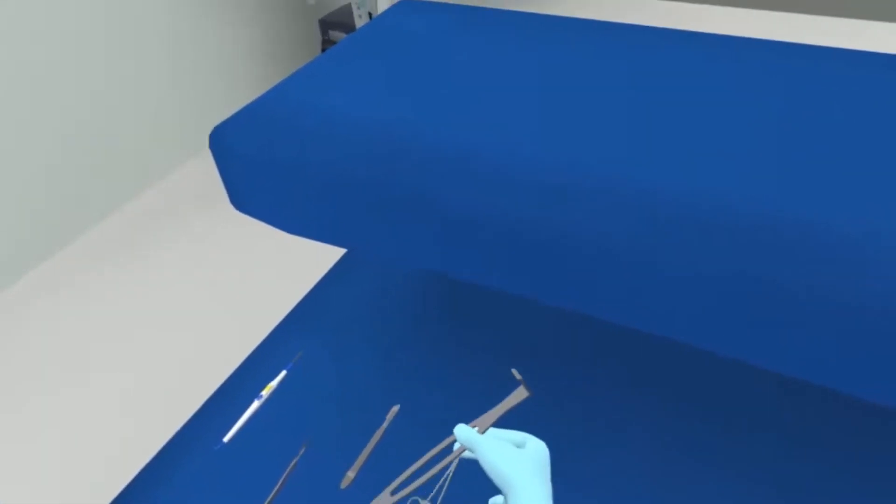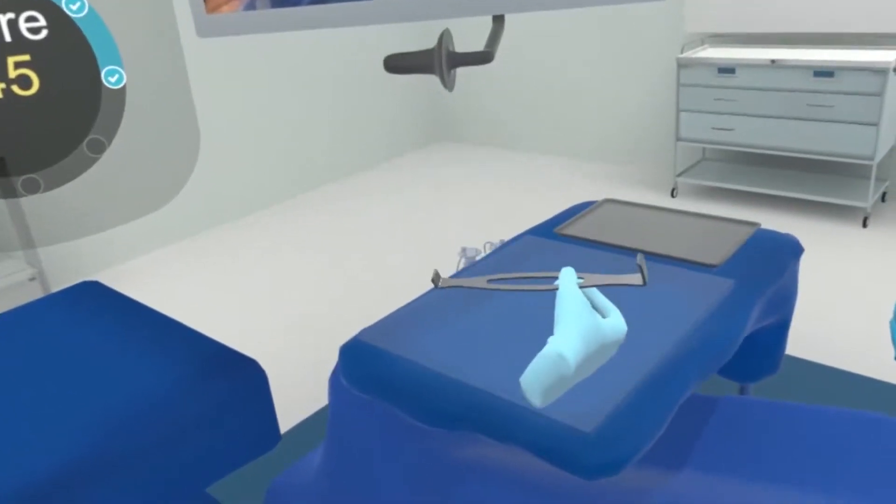Army Navy retractor. Now this one I'm going to put on the Mayo stand. Good.